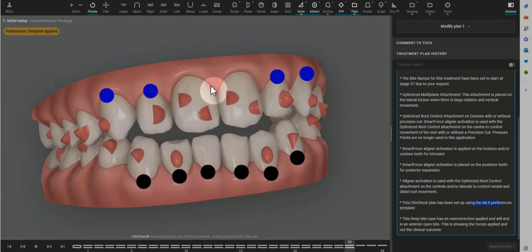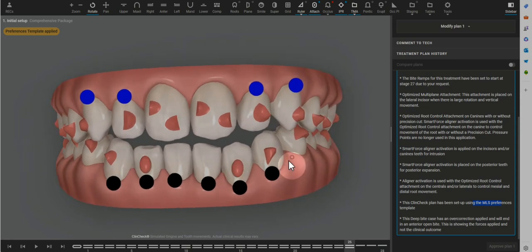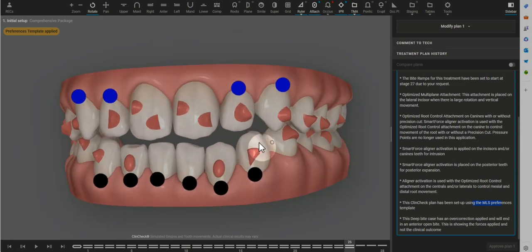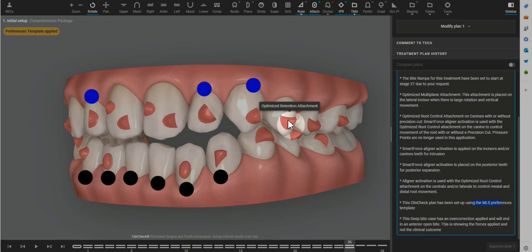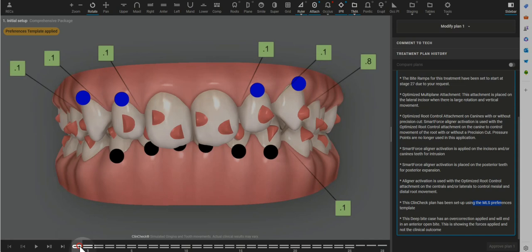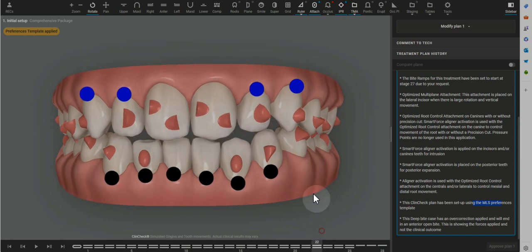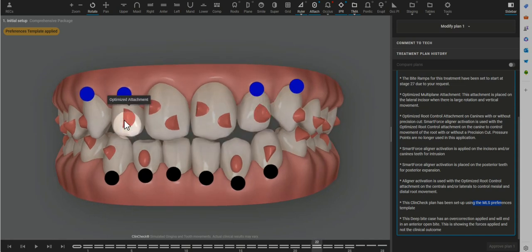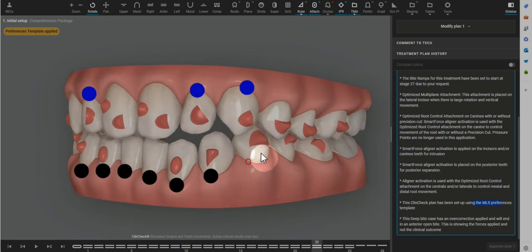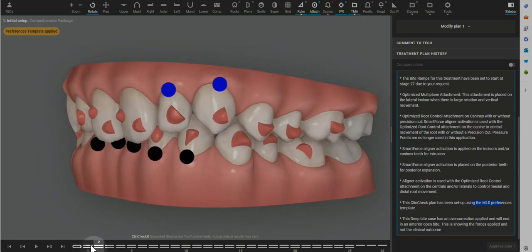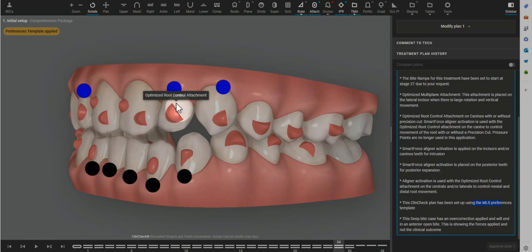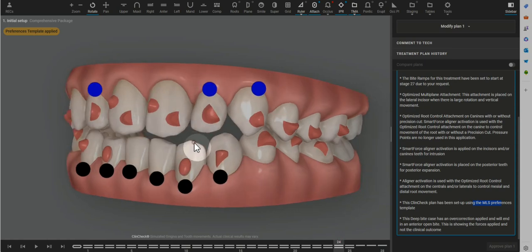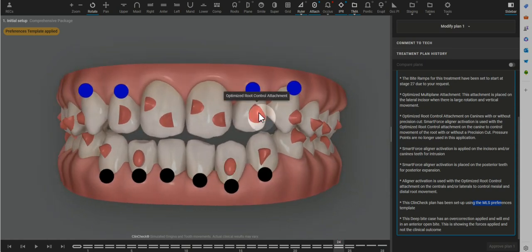The central incisors are big rooted teeth that don't like to push up into maxillary bone. So having an attachment on the lateral that has a flat horizontal surface is going to make this upper intrusion more predictable. I don't just want to change the attachments because these were placed by the software for a reason. So the root control attachment here is generally placed for mesiodistal angulation, which I can identify here, or if there's some significant translation.